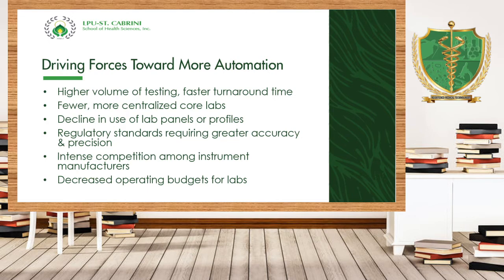So why do we have to do the automation? What are the reasons why hospitals are engaging themselves in automation? Like what I said in our synchronous session, most of the laboratories are using the words fully automated as their marketing strategy to attract more patients, to attract more customers. Since from the word automated, it means that it is much more reliable than the conventional one.